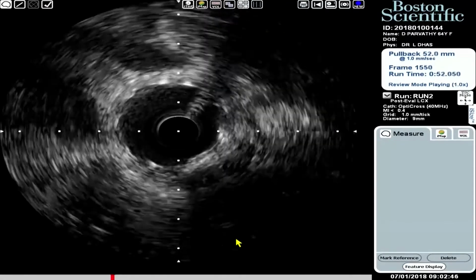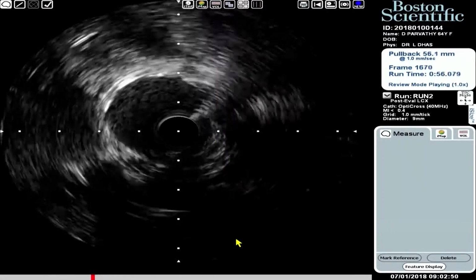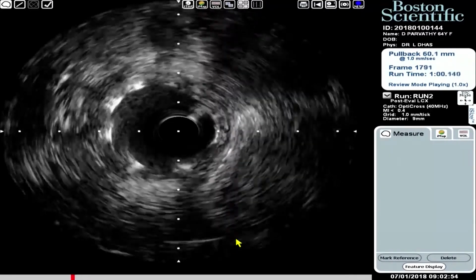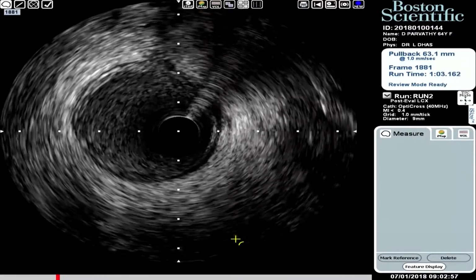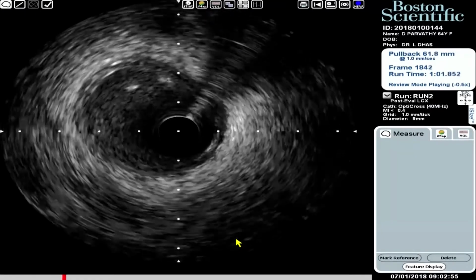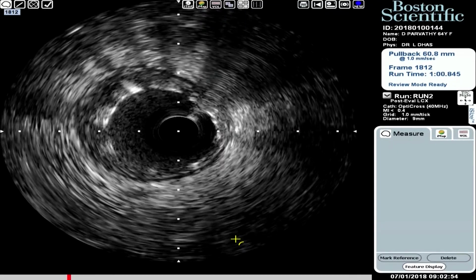You can see the side branch, a lot of plaque here, and eccentrically expanded now. And proximally it looks all right. Little stop here, go 2 frames. So the vessel has become 3.2, 3.4 proximally. So you expect a little malapposition with a 2.75 stent. Because it is a very short area, less than a millimeter, and the stent is well expanded, we are not going to do anything for this.